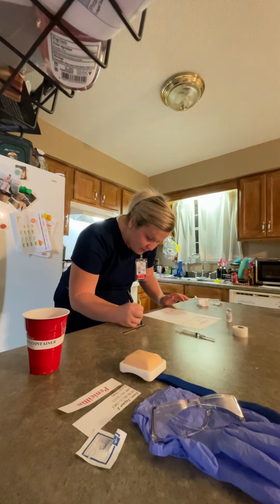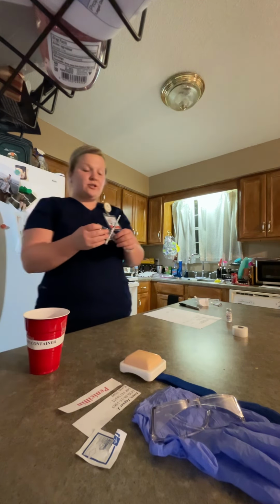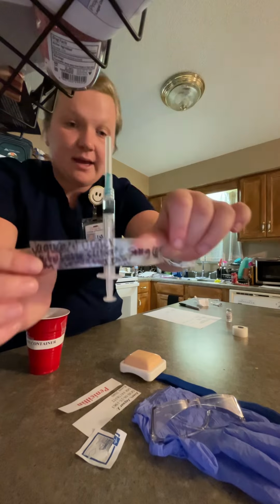PRN, which is as needed, and it is a pain medication is the indication, and that's what I will put on it. Now I'm going to put my label on my syringe, making sure to put it at the bottom of my syringe so I don't cover up how much medication I have drawn. I'm going to get another nurse to check and make sure that this is correct.